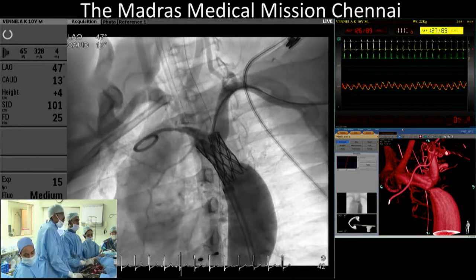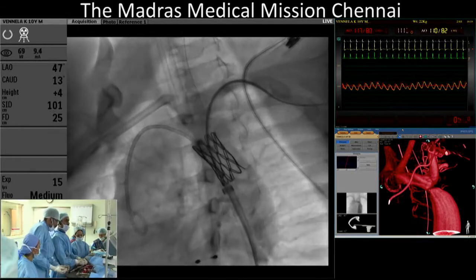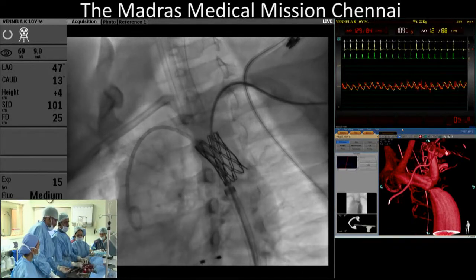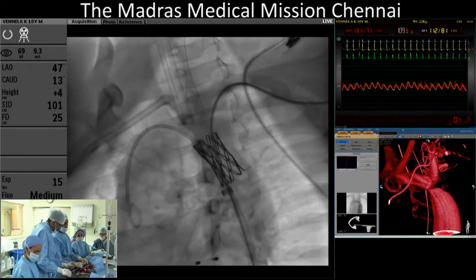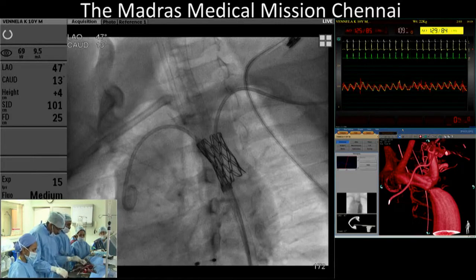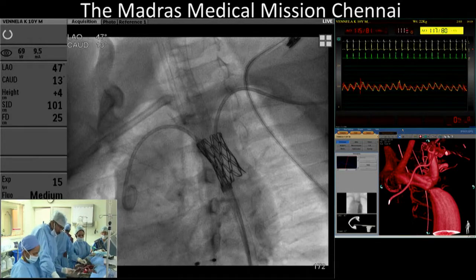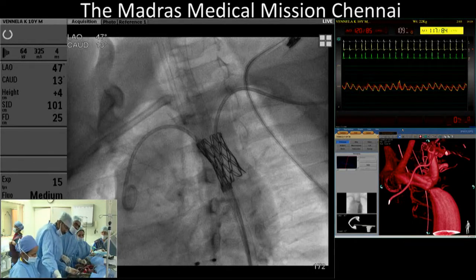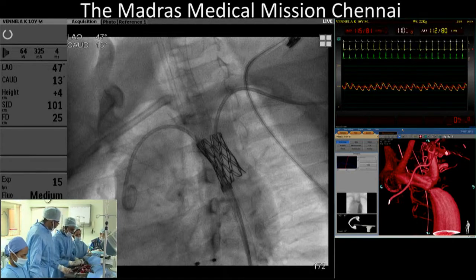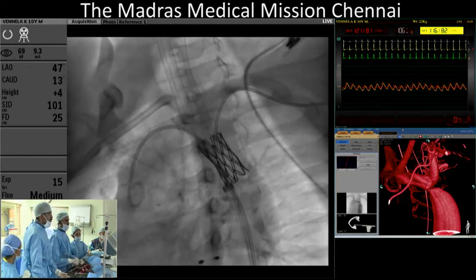And just recently, Hiro in Japan has had the same problem with this. So I asked him to use a Coda balloon, just to flare it. I want a stiff wire on this. Yeah. But if we can do it, we should. Stiff wire. Yeah, I'll do that, Varakan. Now I'm listening to you. So get me a 12 Admiral Extreme and 6 Mustang. 6 Mustang on the subclavian and 12 Admiral Extreme on the arch.